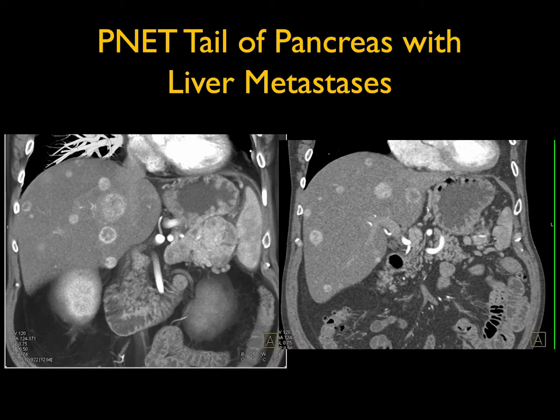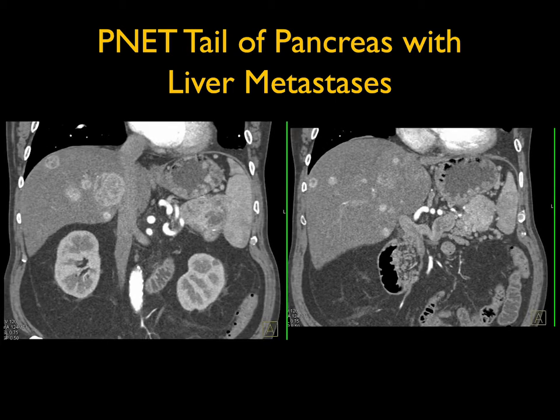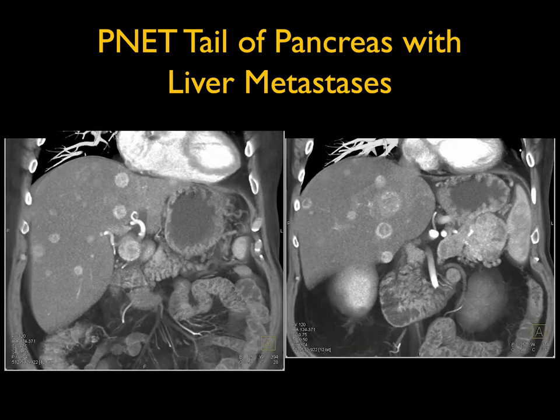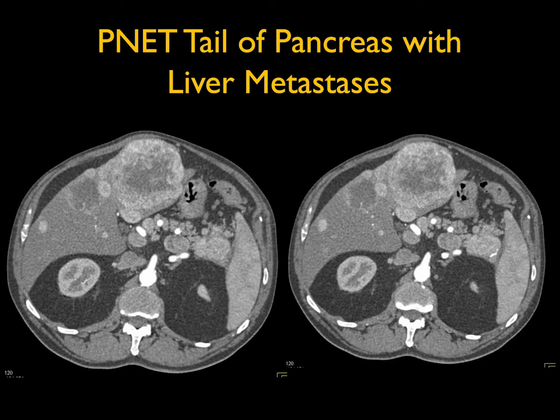CT is really good for detecting neuroendocrine tumors as well as for staging. Radiomics are now able to try and grade neuroendocrine tumors, as well as predicting survival and response to therapy — so lots more coming in this space. This is a really nice look at the typical neuroendocrine tumor: the primary mass as well as the liver metastases.